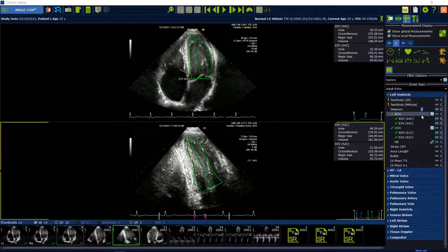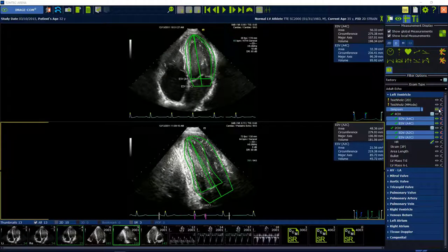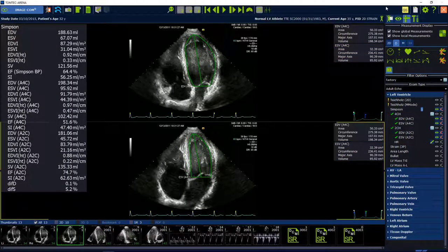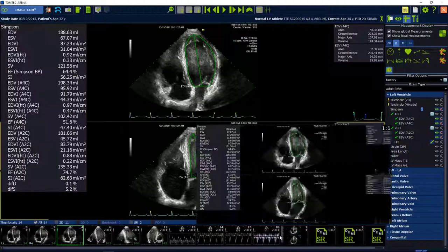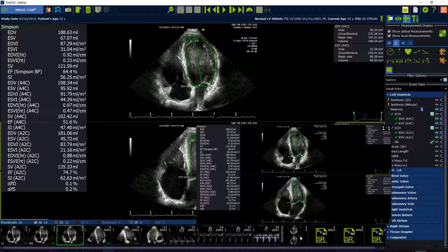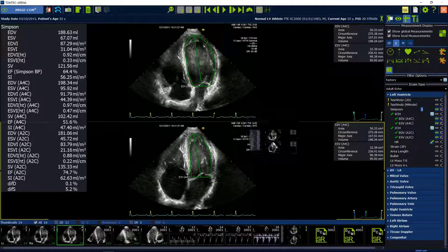Secondary captures can be used to store your results on images and CineLoops, for example. Press the secondary capture button to store a screenshot of the full image region. The new object becomes visible at the end of the thumbnail preview.